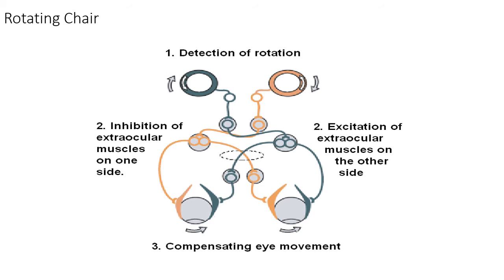So compensatory eye movement after we move the patient, as an example, to the right, is proportional with the head movement. The left ear will be inhibited and the right ear will be excited. So continuous movement can cause eye movements to the left and right, which we call nystagmus. The SPV will represent the movement of the cupula in the horizontal canal.